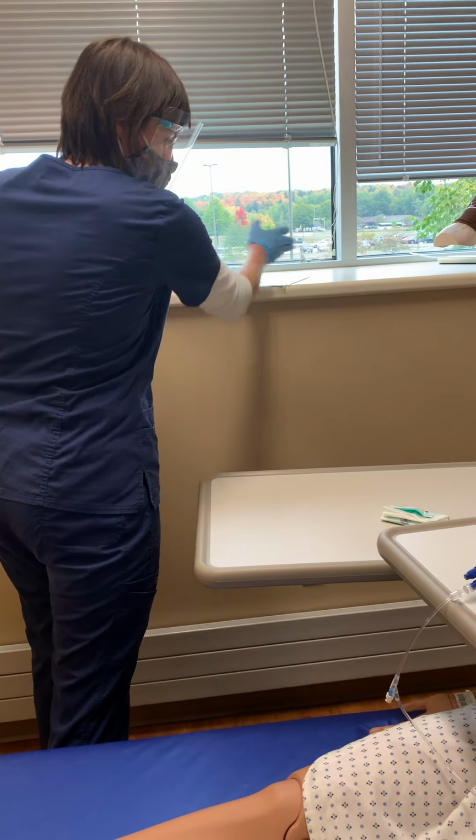With a central line, I would, of course, always be assessing whether or not it was necessary for the patient to have a central line. In Frances's case, she is going through chemotherapy, which is why she has that PICC, for regular access for her chemo. So it is appropriate to have that PICC. The reason we're assessing that is because it can be a very serious infection, because it does go right into that big vein.